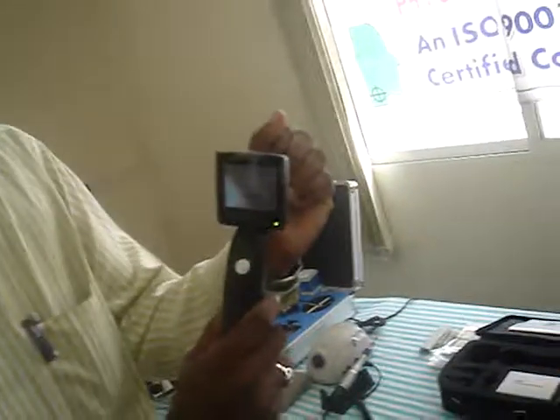And you can insert an image on the monitor, right? And this works on two pencil batteries.